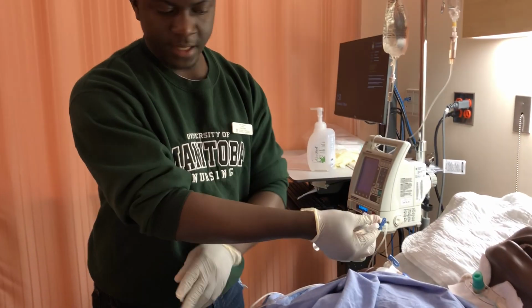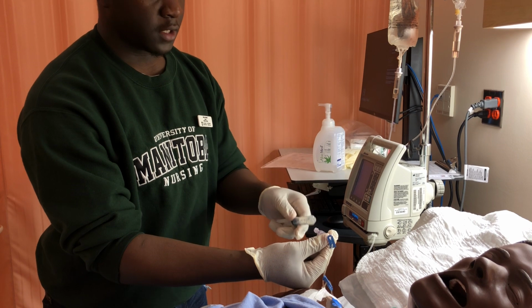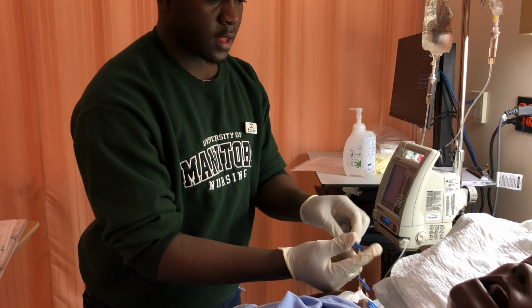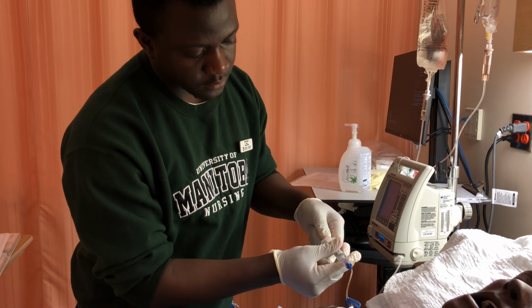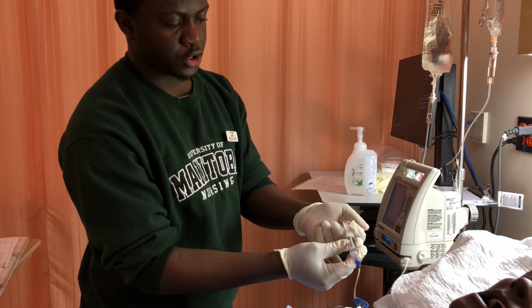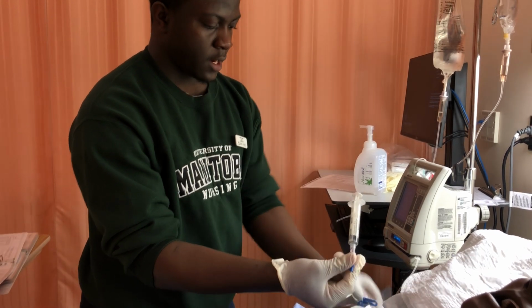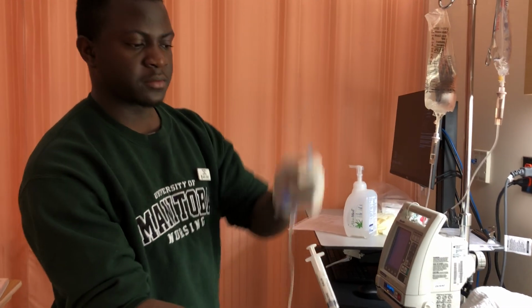Okay. So I have a flush here, and I have cleaned my site. I can just prime a flush here, and then I'll unlock this, and I'll back flush. I see blood, and then I can flush this, push pause, turn this on as well. Follow the tube into here, make sure it goes, and now I can connect my heparin, which has been primed already.